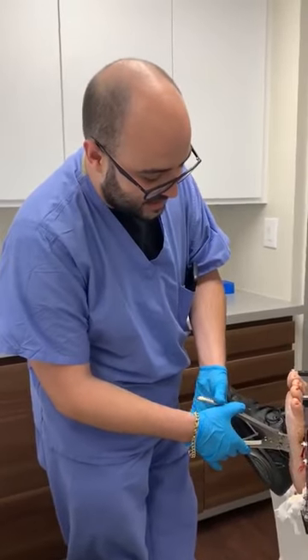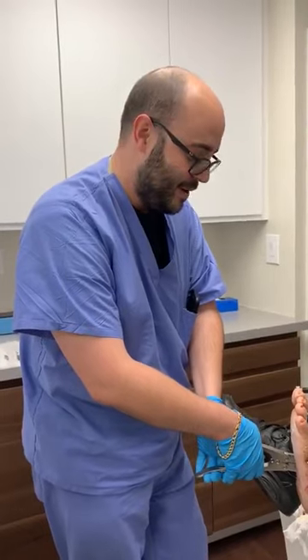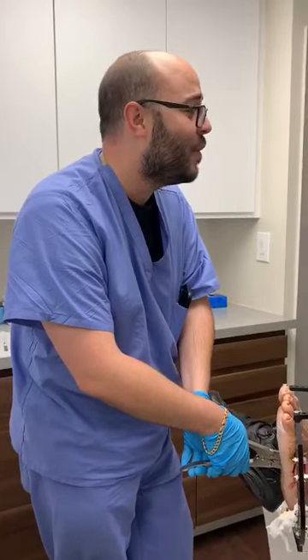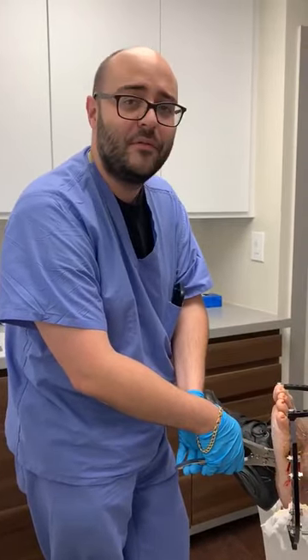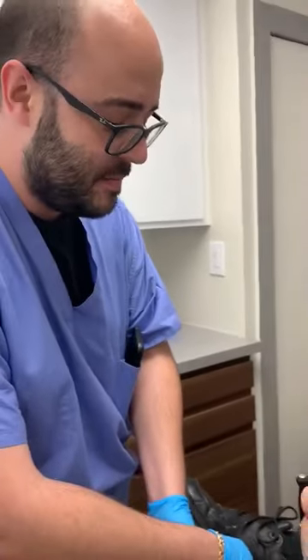Welcome to another fantastic episode of Jaws Podiatry. We are here today removing an external fixator, a delta frame, from this patient's left lower extremity.